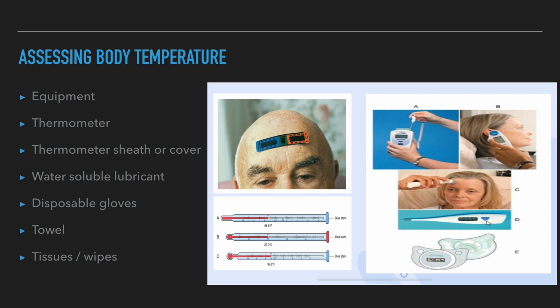These discrepancies can be minimized by using the same ear and device for measurement each time and by ensuring that the user is well trained. Because discrepancies are usually small, the convenience, safety, and efficiency of tympanic temperature measurement outweigh its disadvantages. The tympanic membrane thermometer is appropriate for infants older than 2 months or very young children who may have difficulty remaining still for extended periods.